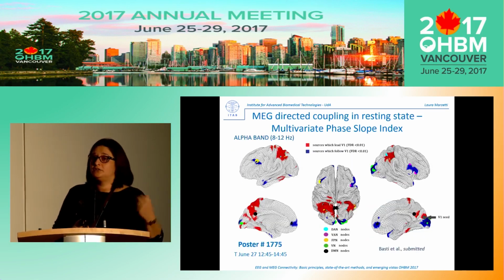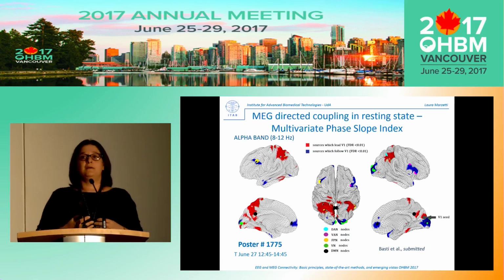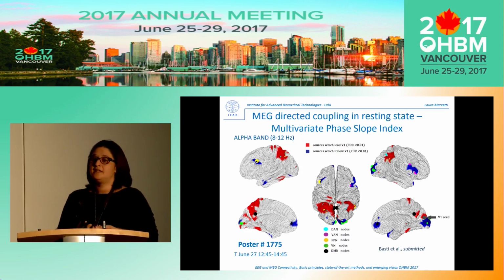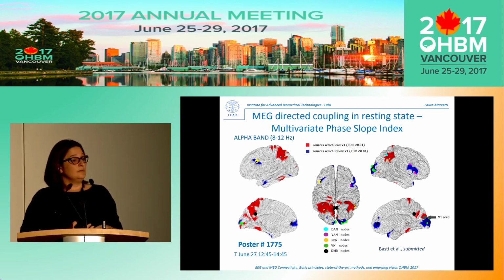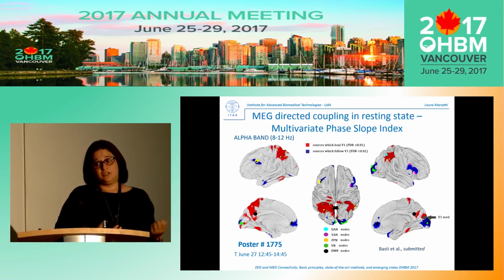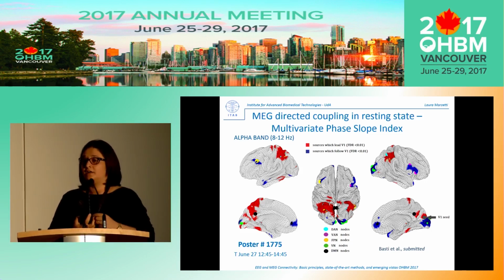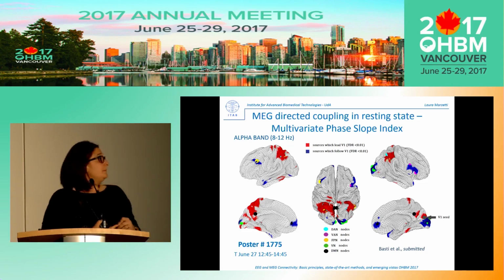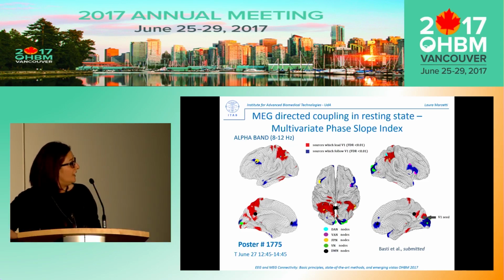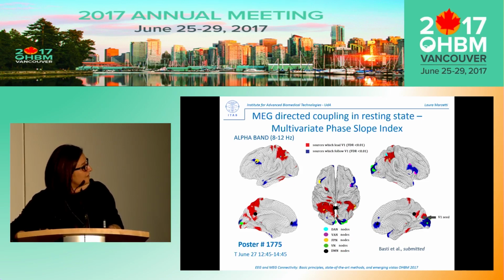But I wanted to have this last slide here because this speaks again for some resembling of resting state networks as seen by fMRI, and resting state networks as seen from MEG data. These are the MEG data of the Human Connectome Project, in which part of the methods that are being used in this talk have been also developed. And what we see here are the major nodes of the more well-known resting state networks, which are represented on the cortex as colored dots.